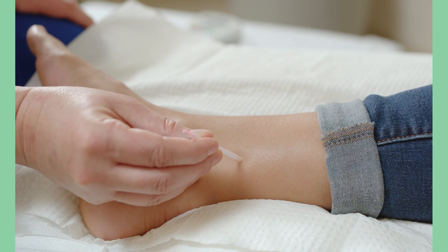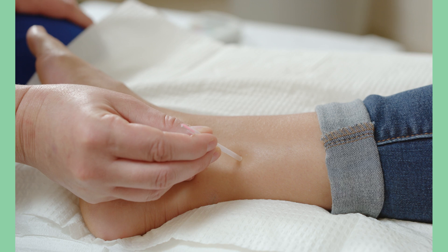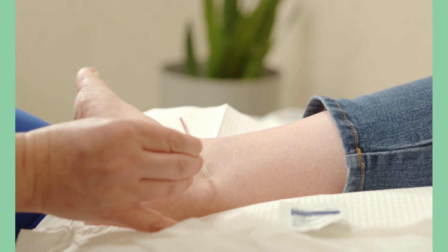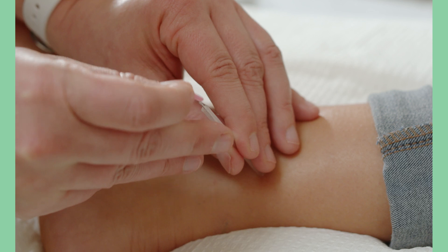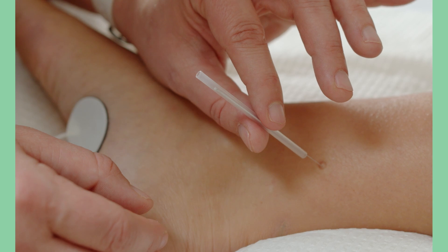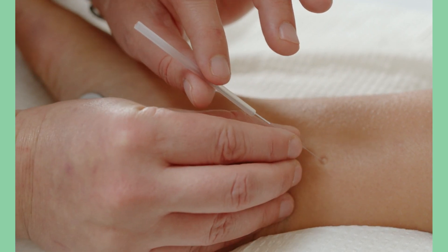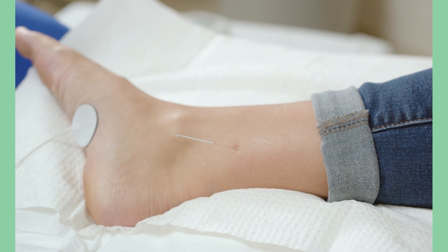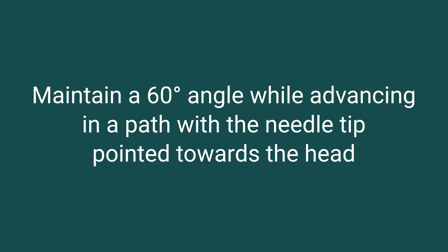Before removing the clear guide tube and pink stop plug, place the needle electrode over the insertion location at a 60 degree angle from the ankle pointing towards the head. For patients with larger ankles and patients with edema, we found that a larger angle such as 90 degrees works better. Remove the pink stop plug, then gently tap the top of the needle electrode to pierce the skin and remove the guide tube. Using a rotating motion, advance the needle electrode until approximately three quarters of an inch or half the bottom portion is inserted into the leg. It is important to maintain a 60 degree angle while advancing, with the needle tip pointed towards the head.